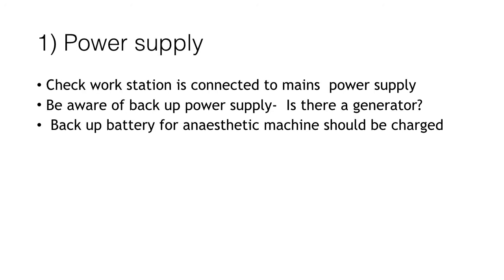The first stage in manually checking the anaesthetic machine is checking the power supply. You should check the workstation is connected to the mains power supply and that this is switched on. You should also be aware of any backup power supplies that are available, for example generators. Backup batteries should be adequately charged so they can be ready to use if required.